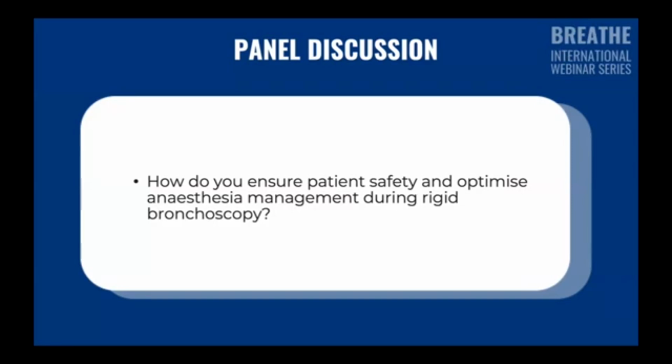So especially for people who are starting the interventional pulmonology program initially, it is of paramount importance that you are very sure with your intubation skills as well. Many times there will be cases where you may feel a difficulty in intubating with a rigid bronchoscope, and if you are not good at your intubation skills, you may land up in a complex scenario. So before you really start doing a rigid bronchoscopic intubation, getting skills in routine intubation training gives you a lot of confidence in handling the airway.